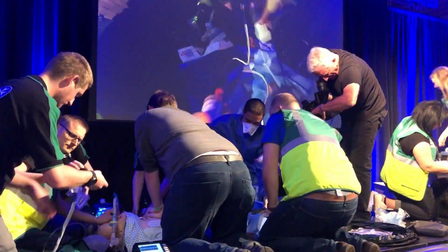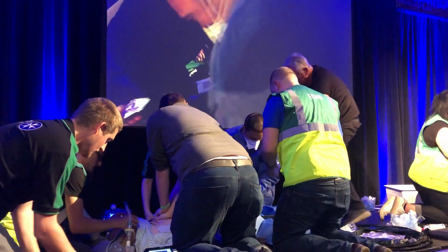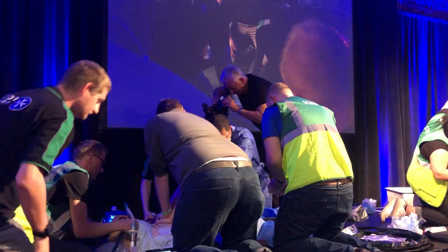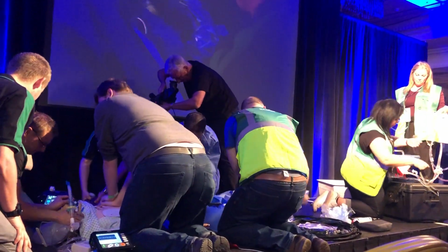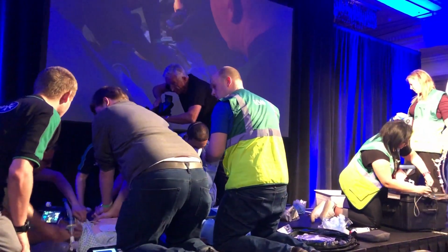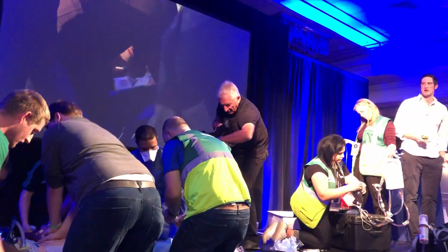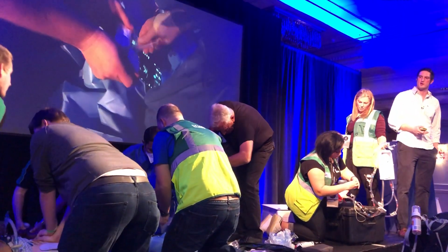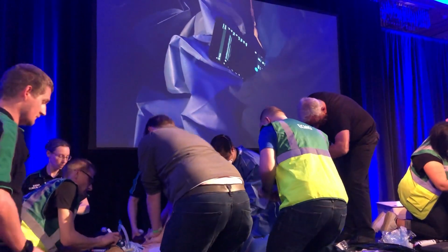So we've got funky portable ultrasound, which I don't know if they can see on the screen, but it's all these kind of things that help save a little bit of time. At the 2 minute rhythm check, the operator is basically going to use our ultrasound to identify the femoral vein and femoral artery. It's going to be on the same side in this manner because fidelity is a little bit low.